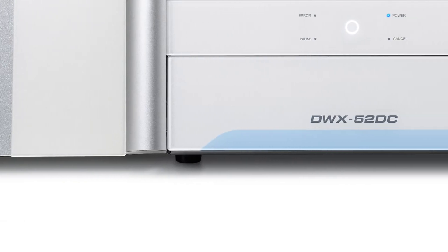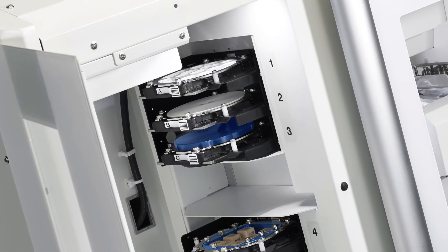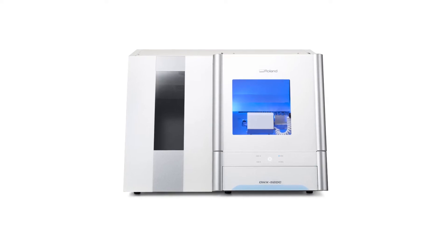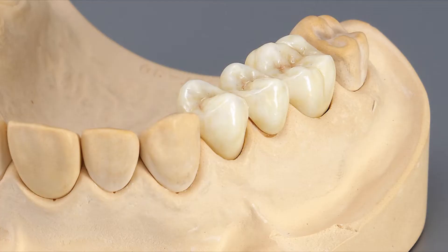The DWX52DC is a highly productive, truly flexible, and extremely profitable dental milling machine uniquely designed for today's dental restoration professionals.